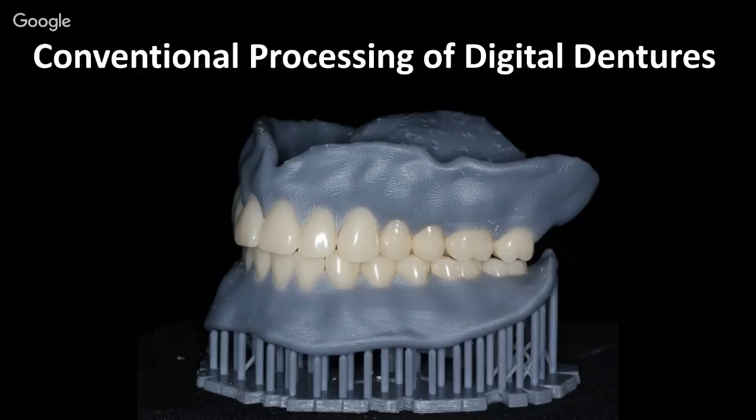Once I've done that, I'll air blast them out. I have a little steam cleaner I bought off eBay that's real cheap. It works though. You could steam clean the teeth, or you could clean them with alcohol, but basically you just want to get all the oil from your skin off the teeth, and you want to get any of the denture tooth debris from grinding on them off.